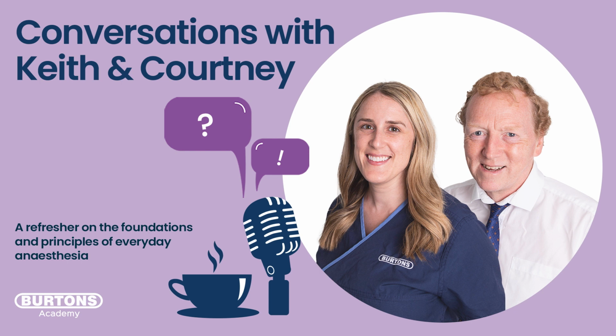drive. So a long-winded way of saying that what we need to do is look at CO2 levels and exploit the stretch receptors reflex with the Hering-Breuer reflex, and we'll talk about this later. But you'll basically then have an animal which loses its respiratory drive, and the ventilator will then have control. And there's one consequence from that.